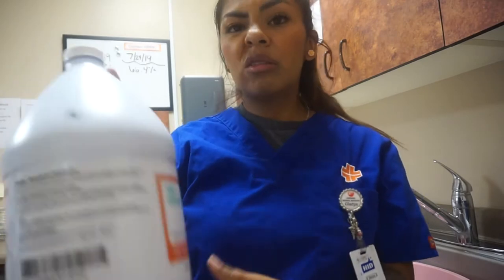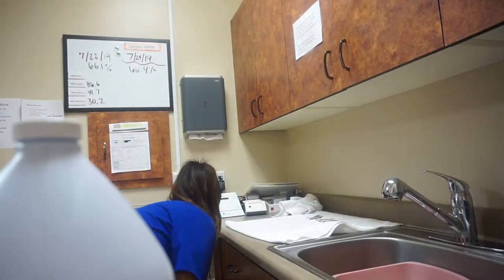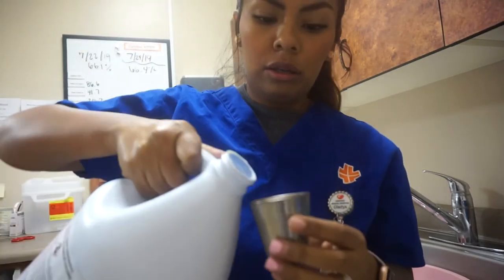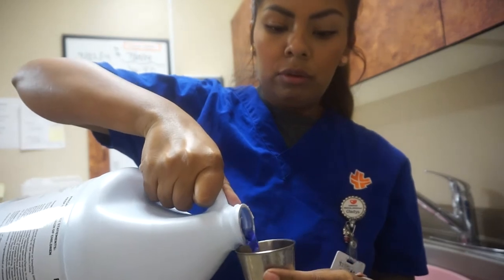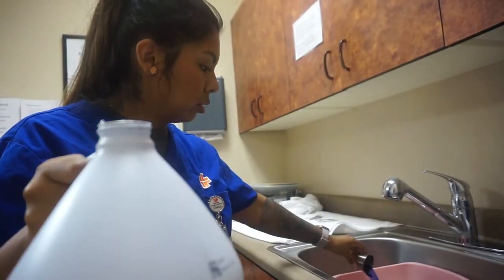And then we're going to use the detergent. We're going to do two shot glasses of this, which is about two ounces, I believe.